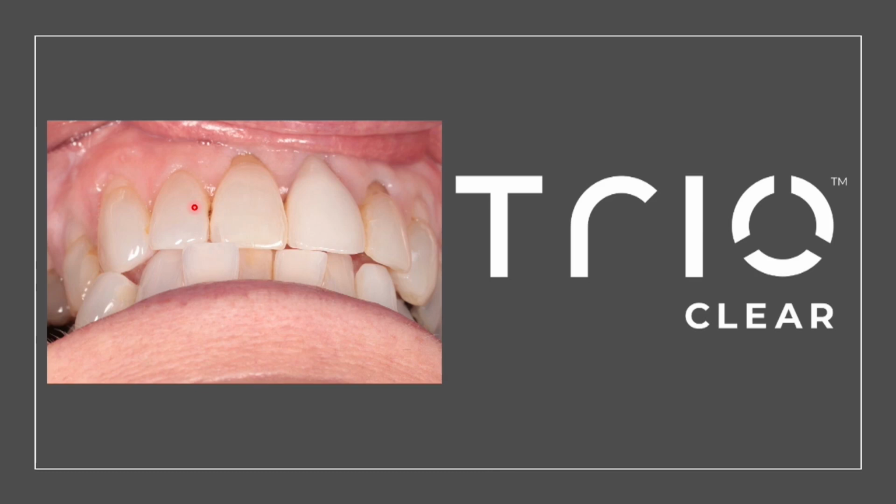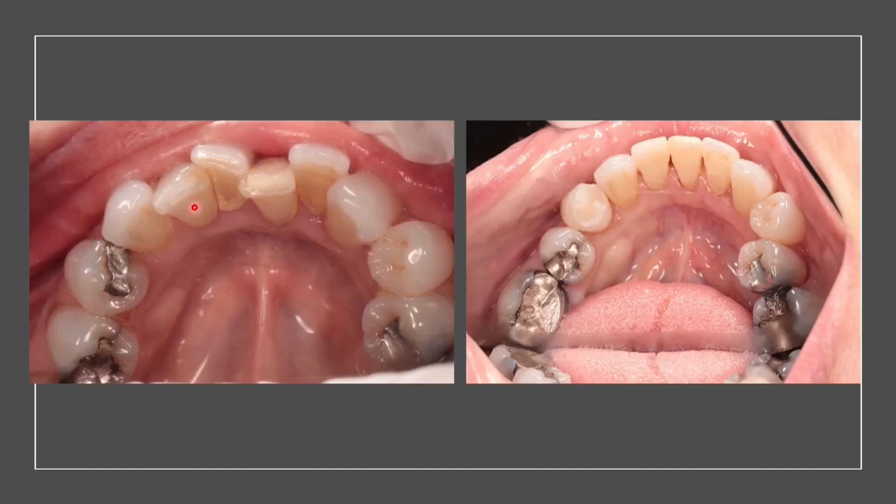So show you the finished case here, and you can see this did involve removal of an incisor in order to give us a better arch form and create space to bring back that tooth in crossbite. Nice arch form at the end of that.